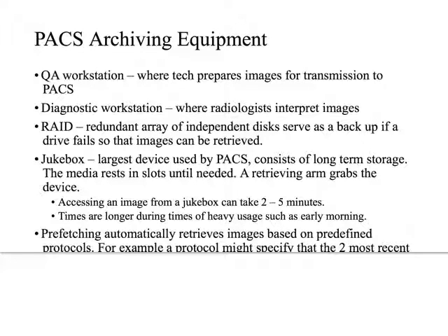So the archiving equipment, the stuff that's going to help us manage this, is going to be a QA workstation. The best way to think of it, back in the day we had QA workstations where we actually sat and looked at images and determined if they were good or not. That is not so much the case anymore because of the amount of workflow and the amount of imaging that we're doing. But generally this is where the technologist is going to be preparing the image and sending it off to the PACS.